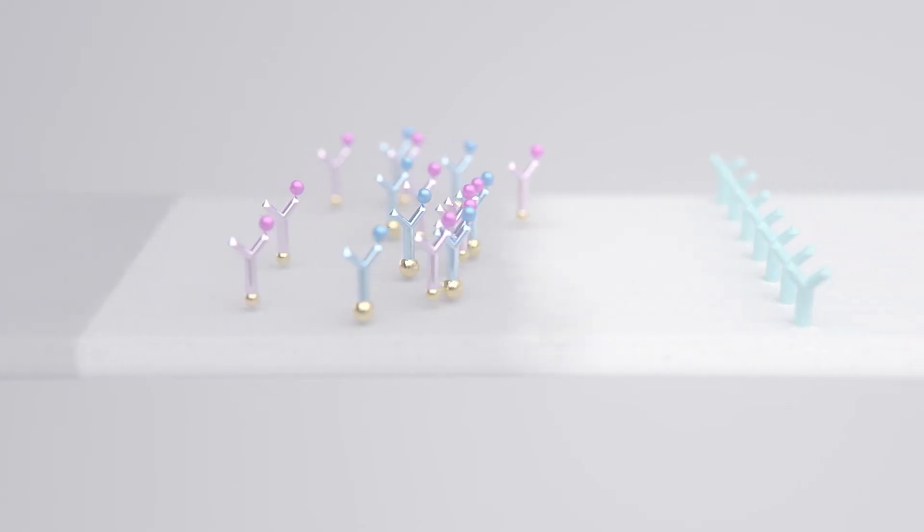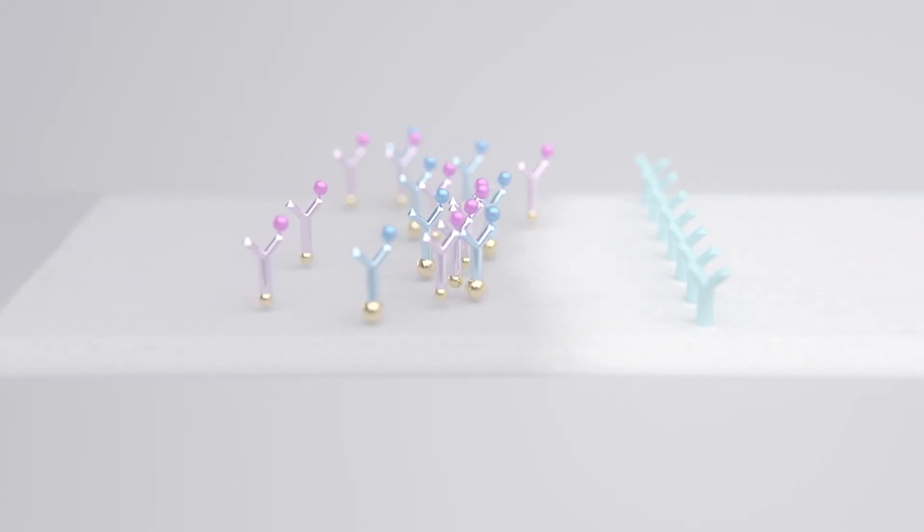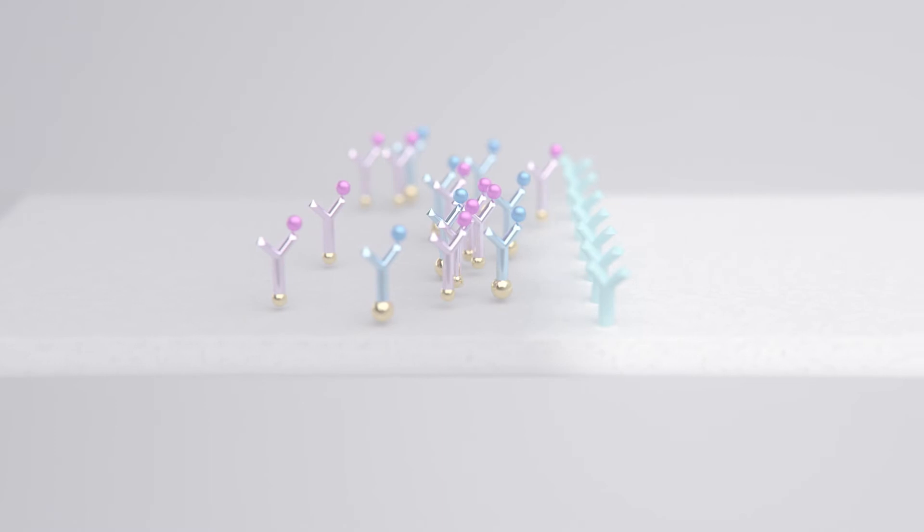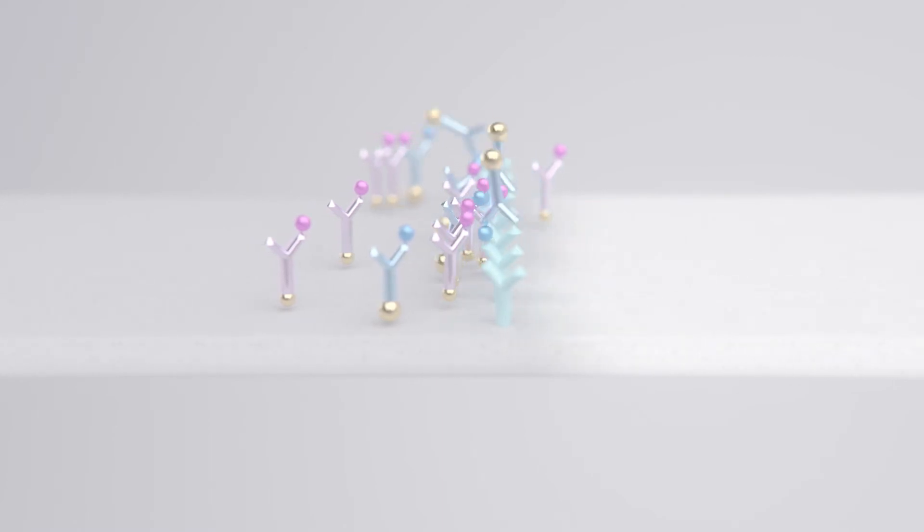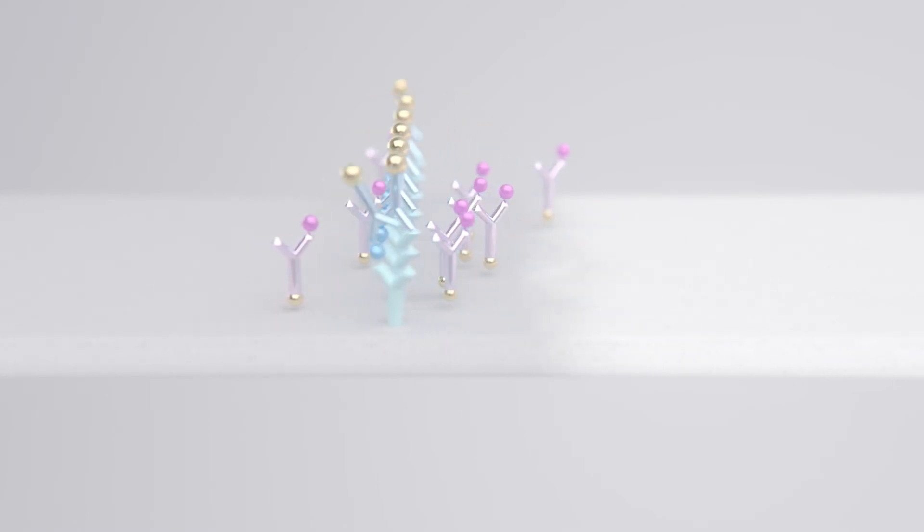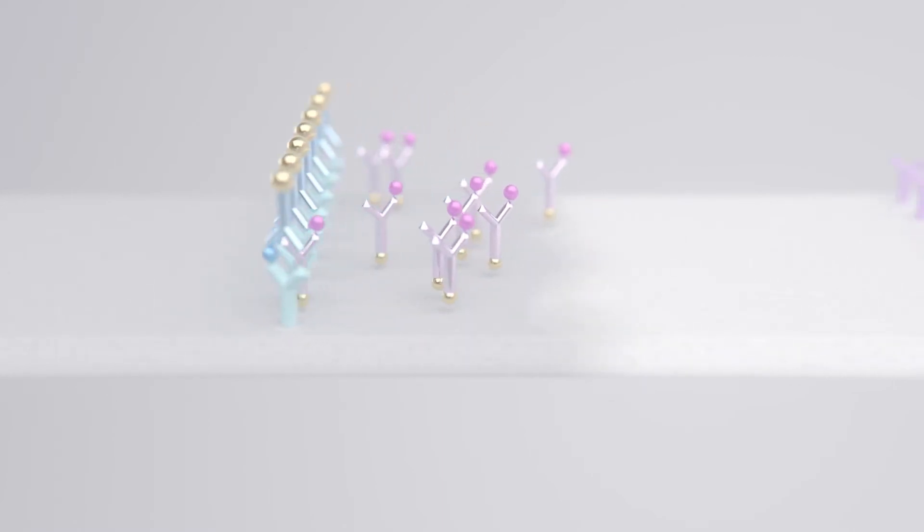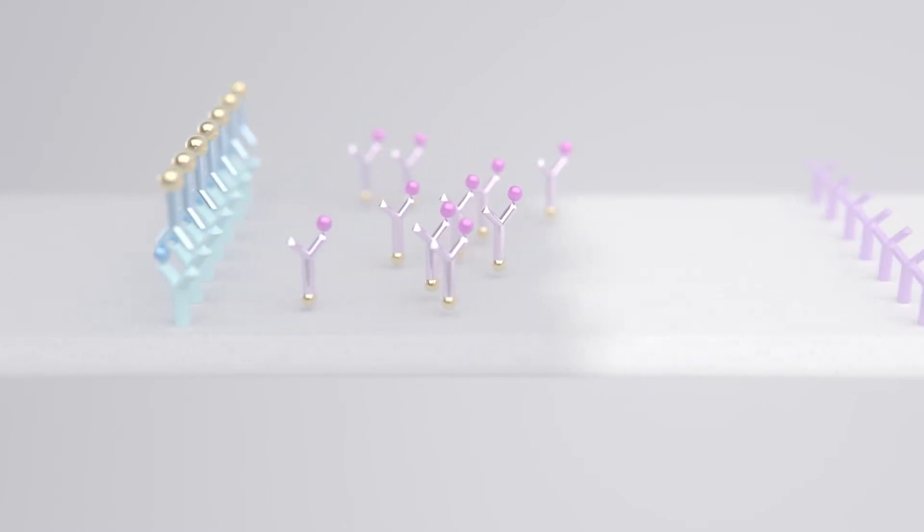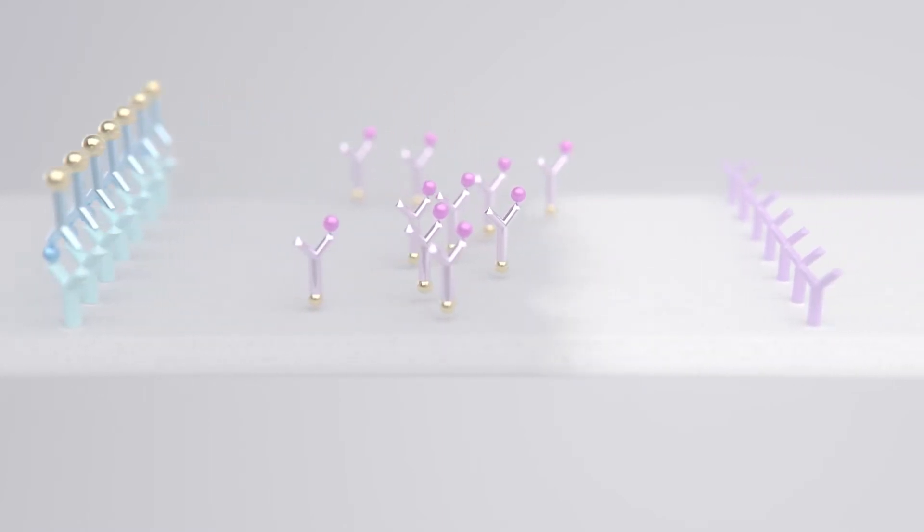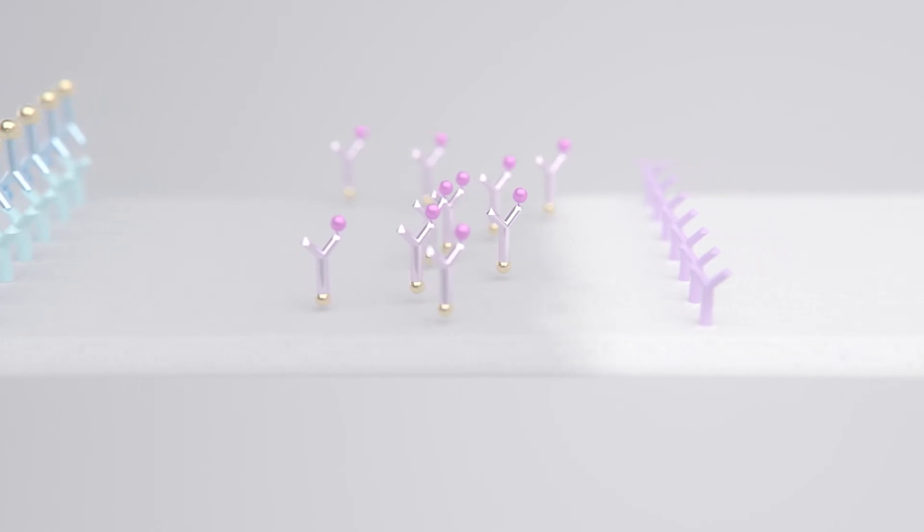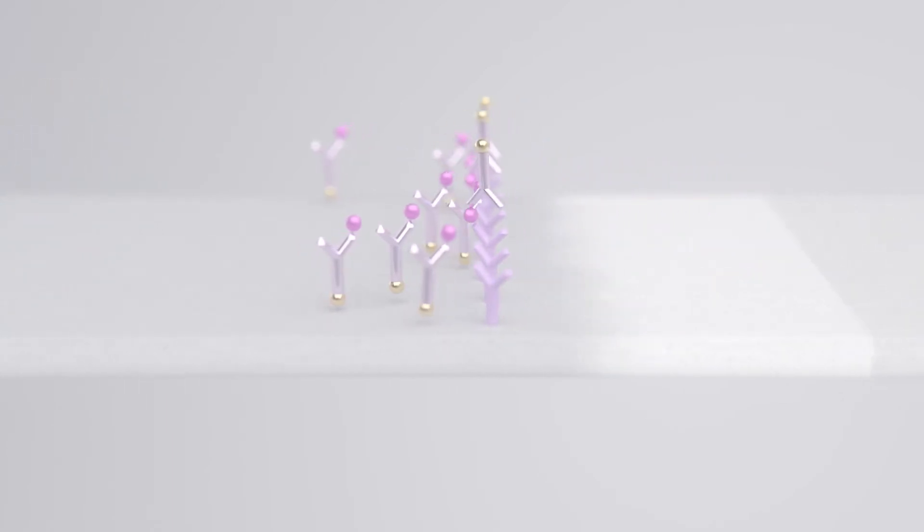the target analyte and associated conjugated antibodies come into contact with specific reagents within the test and control line. The conjugated antibody recognises the unique part of the target molecule and binds, creating a line, indicating a positive result.